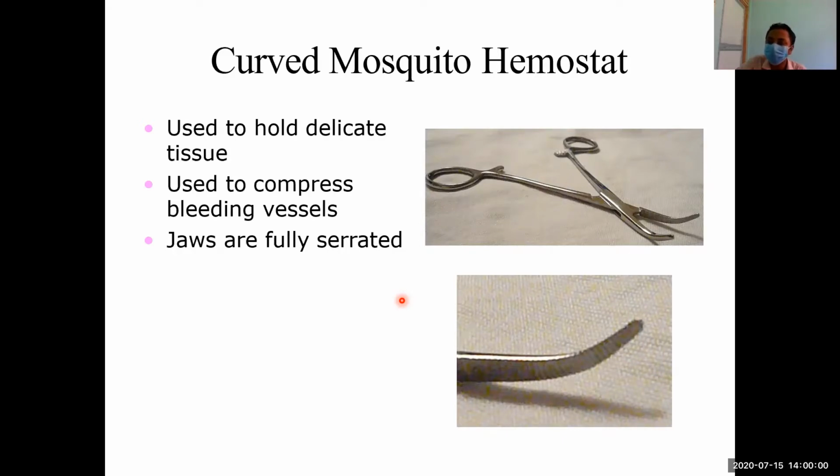Again, for blunt dissections, supposedly in a lipoma or a sebaceous cyst, if you want to dissect just below the skin and subcutaneous fat and above the lipoma or the lump, we will do that dissection with a hemostatic forceps. Those are the uses of hemostatic forceps: for blunt dissections, for achieving hemostasis, in appendectomy to split the muscles, and to hold tough structures like aponeurosis and muscle sheaths.